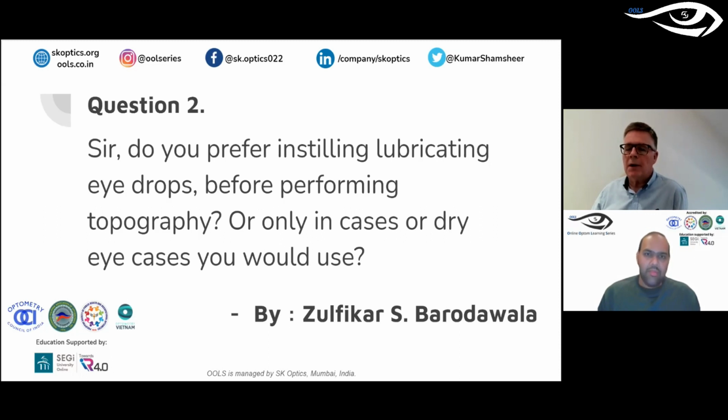Very visual, and patients love topography. It's not a difficult concept for them to understand. If we show them OCT, that's very difficult for a lay person to understand. But topography, very, very simple. Your average patient with a reasonable intellect understands the contour map.